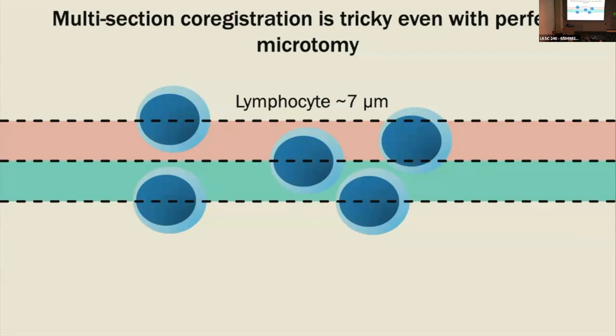Yeah, for anybody that's curious, David Rimm at Yale, they've looked at this a lot. I had a conversation with him a few years ago, and he reiterated what Albert's saying, which is that probably the biggest cause of artifact is not usually fixing for too long in formalin. It's the tissue sitting ischemic and not getting fixed. So the ischemia time seems to be by far the biggest source of artifact.